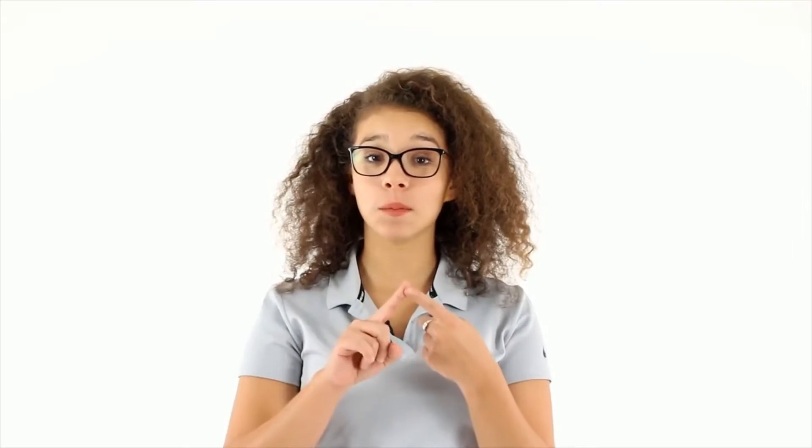Hey guys! It's D'Andra with Vive Health and in this video I'm going to show you how to set up, how to use, and how to drain your cold therapy device.